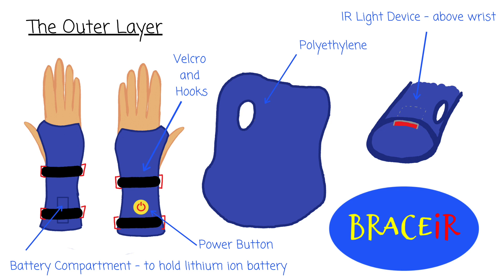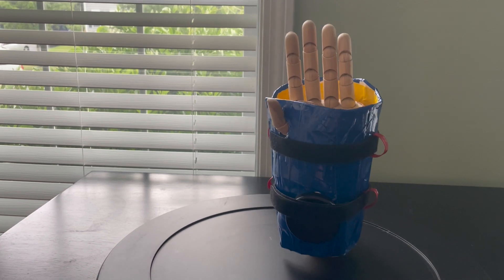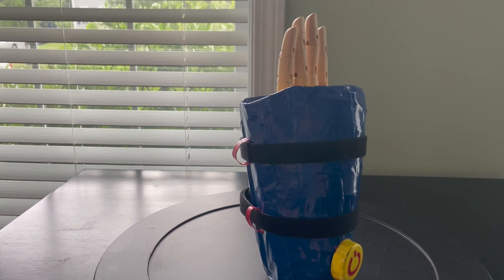The lithium-ion battery, as seen on the bottom left, would be rechargeable and wired to the IR light source. And here's our Bracer prototype. Let's dive deeper into the various components and their functions.